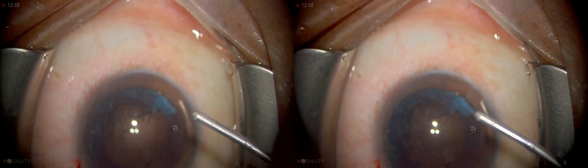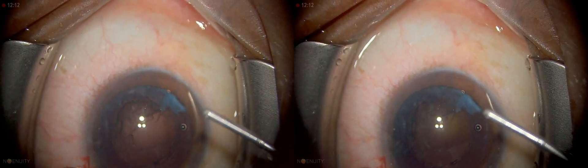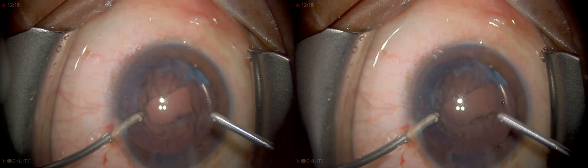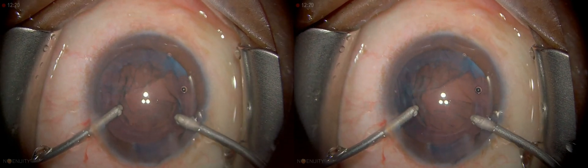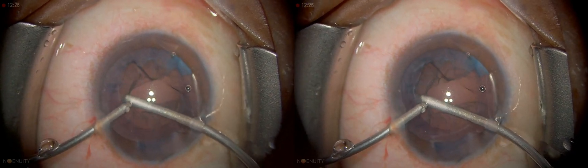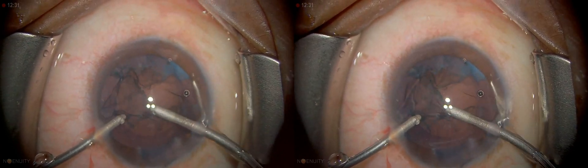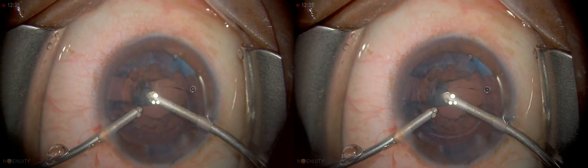I'm using bi-manual, like all my cases, going with the infusion first to make sure the anterior chamber is deep, because otherwise it is possible to cause a Descemet's tear — Descemet's detachment. If you do get a Descemet's detachment, the main thing is to recognize it early. Cortical removal in a radial fashion.